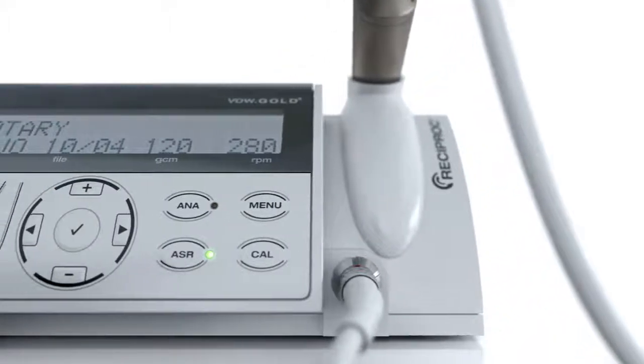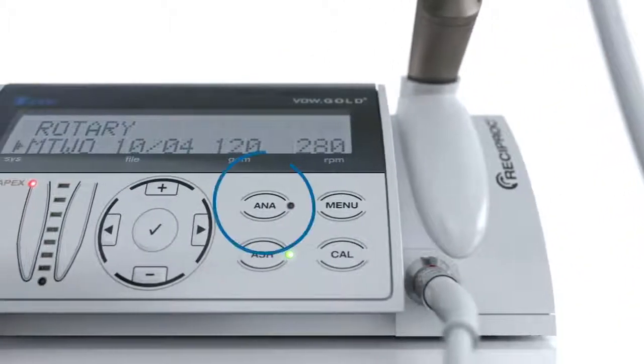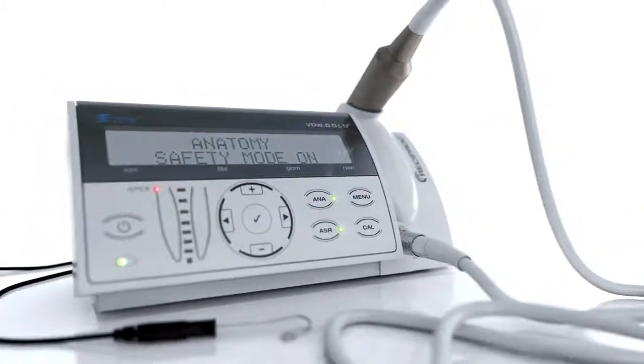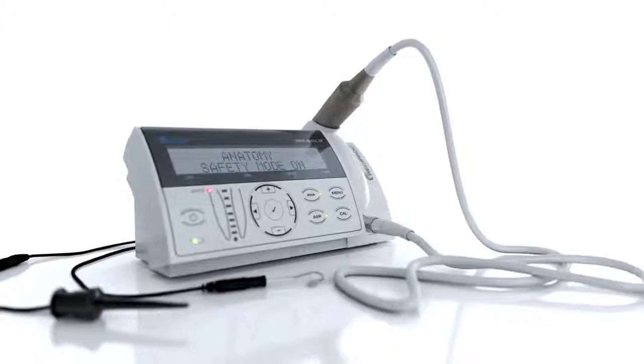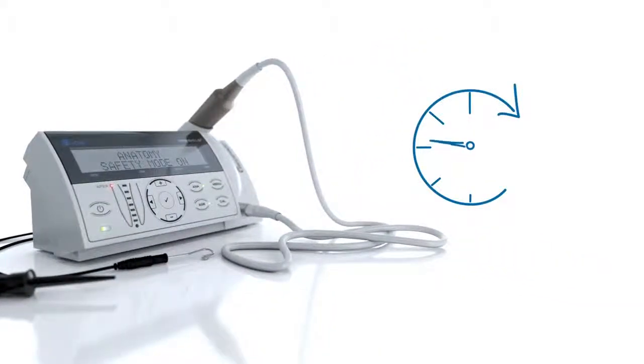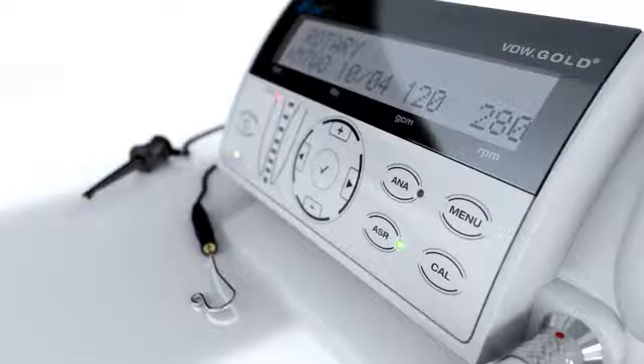The second safety function for rotary file systems is activated by the ANA key. The abbreviation ANA stands for the word anatomy. When the ANA key lights green, all torque values are lowered. This can be helpful when preparing difficult canal anatomies.